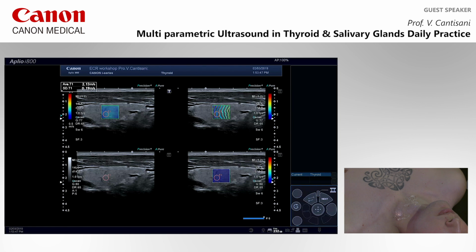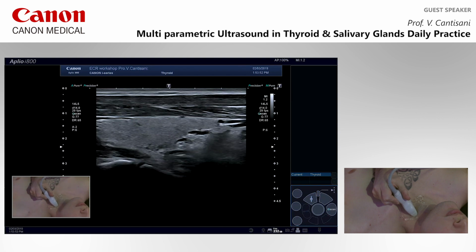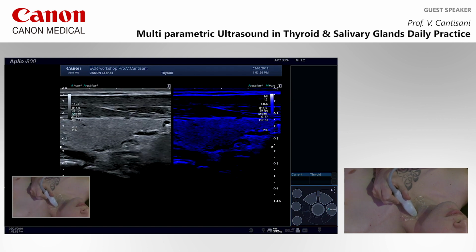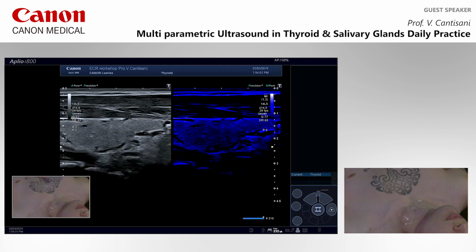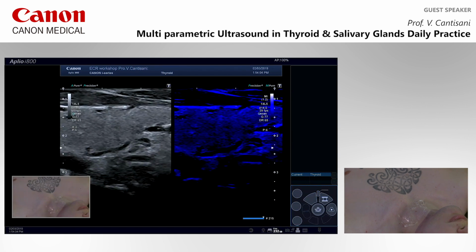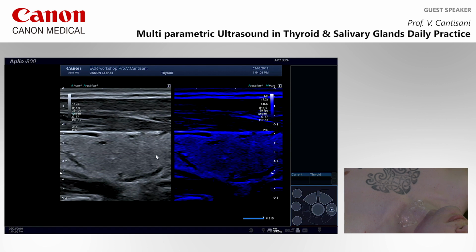So I showed you what we can do with all the different modes, but still, there is something else. I told you micropure. So you put micropure, and then you look for possible calcification. There is a vessel here, look. And in the vessel here, there is a very, very tiny calcification, very nicely and precisely depicted. So also in a normal patient, you can find something to show how to use a different software. If someone of you wants to try, I can help you.